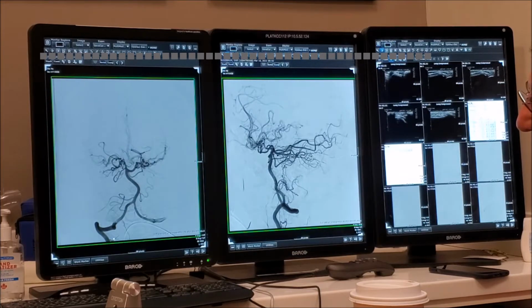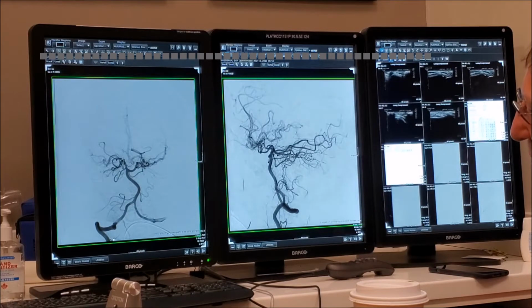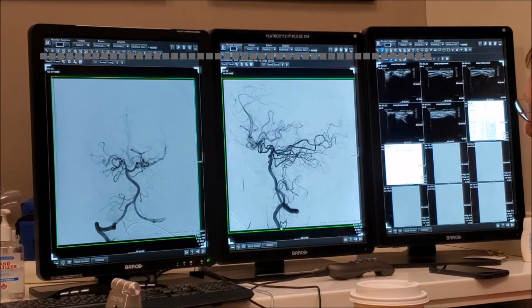Okay, so there is a branch here, right? You might have native there too. Well, yeah, we do as much as we can, and we can see it on the other view, right? Could be this one, this similar caliber, right?